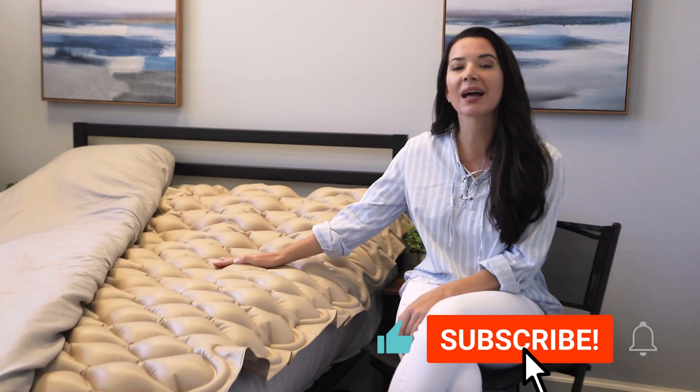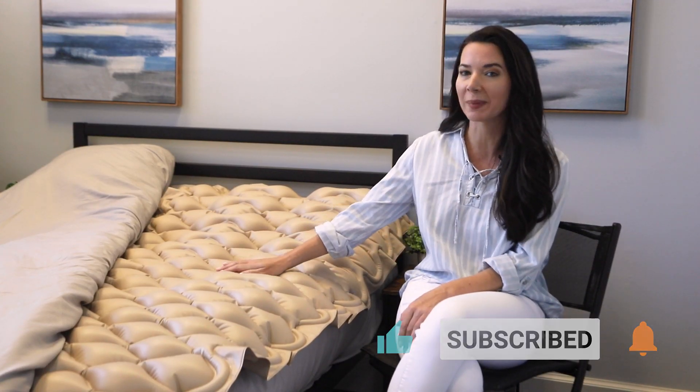Are you or someone you know experiencing pressure sores or irritated skin from extended bedrest? Introducing the VIVE Health Alternating Pressure Mattress.